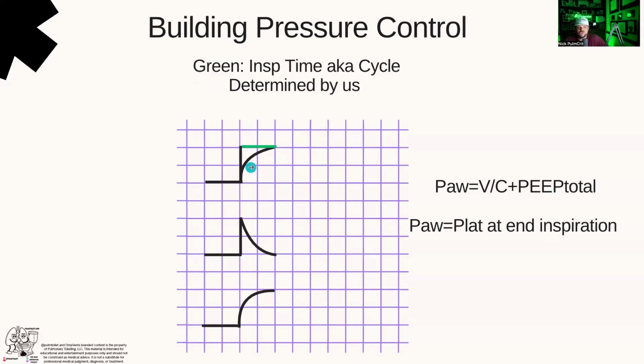All right, so let's assume that at the end of inspiration, your airway pressure equals your alveolar pressure. And this will be important because as we talk about changing each of the variables, if you assume that at the end of 1 second the airway pressure equals the alveolar pressure, then you're not going to have any flow, right? The pressures will equalize. You'll have no flow at the end. So we're going to make that assumption.